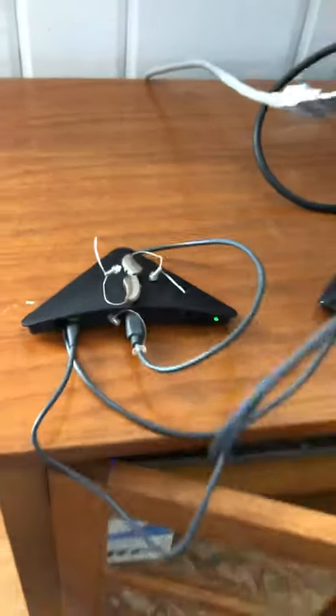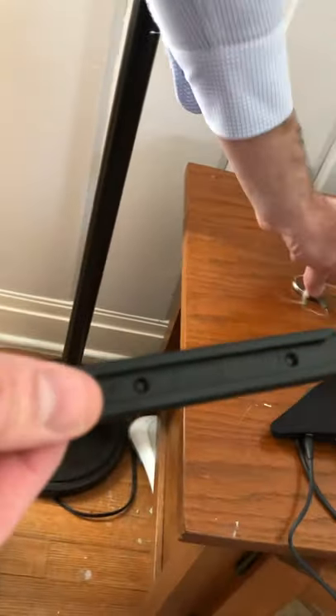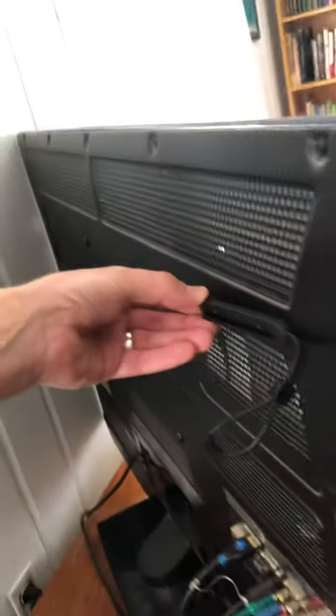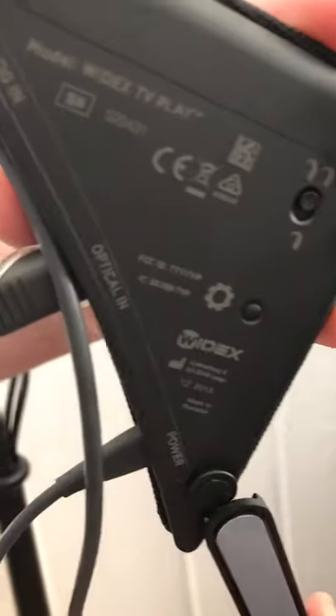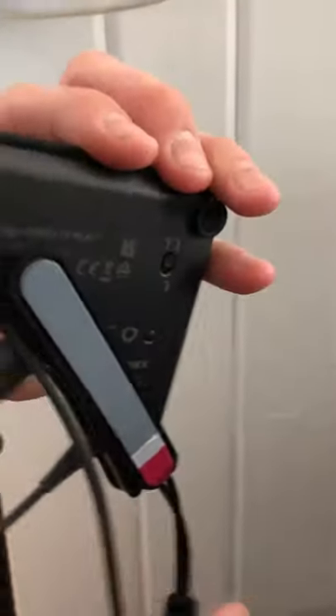The one last thing to show you is this mounting bracket. I'm not going to put it on the back of the television, just show you how this works. There's an adhesive portion that you remove and you'll be able to stick it on the back of your television. Then you take the TV Play, turn it around, and slide it in like this. Once you have that in there you can mount it to the back of your television discreetly. It's not critical — you don't have to mount it, but some people like to.